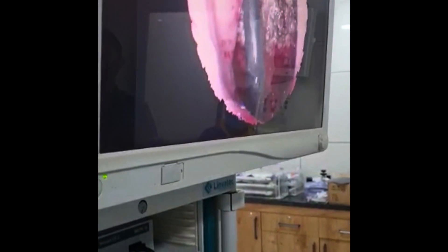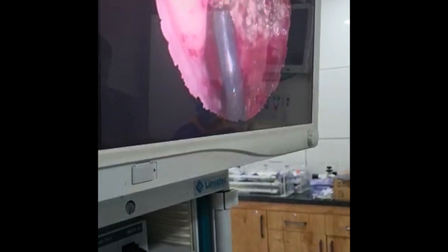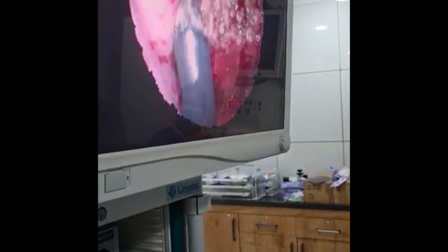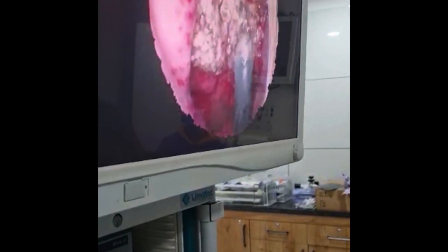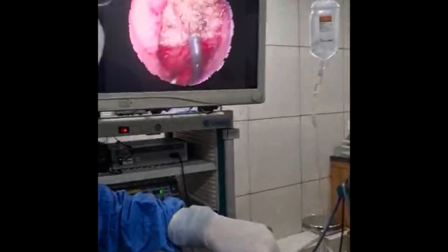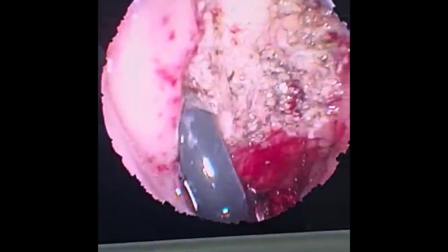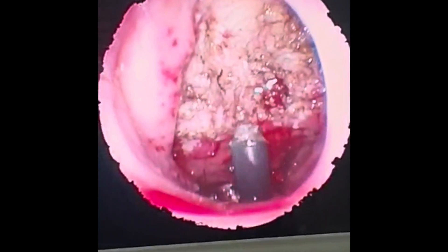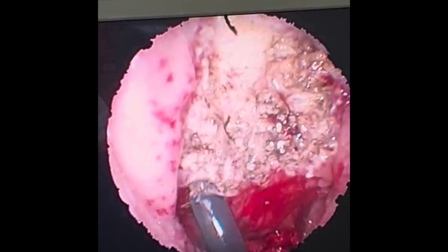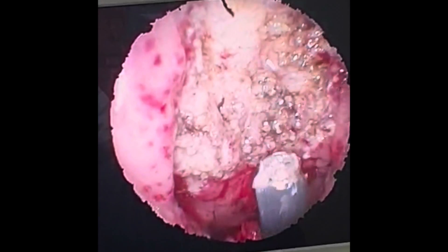Recurrence only happens if you have done partial surgery. In adenoid surgery there is a wonderful result if you resect 100 percent. These are the best methods available. Looking through the nasal endoscope at the adenoid is just like seeing a beautiful sunset from the roof of your home — you can see this wonderful adenoid in transnasal endoscopy.